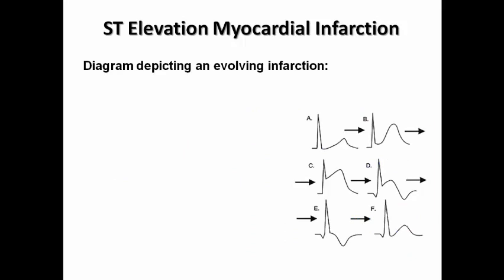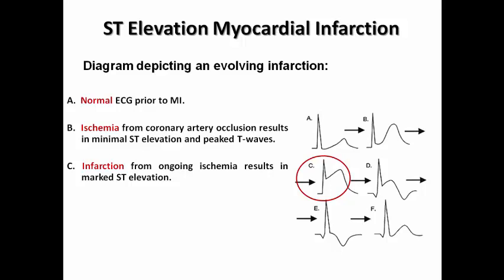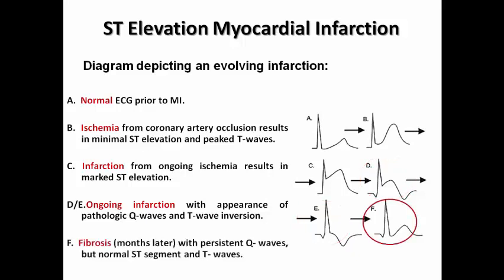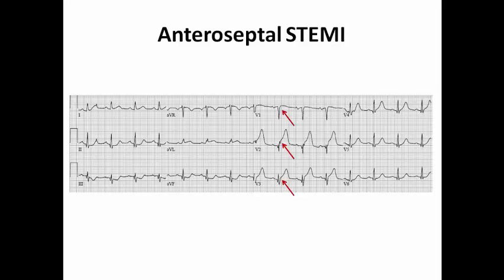There are evolving ECG changes in STEMI. Initially the ECG is normal, then the patient develops ischemia due to coronary artery occlusion, with minimal ST elevation and hyperacute T waves — the hyperacute T wave may even precede the ST elevation. Then frank significant ST elevation develops. If not reperfused in time, pathological Q waves and T wave inversion develop. If reperfusion is missed entirely, persistent Q waves remain while the ST segment and T wave return toward normal. For example, this ECG shows ST elevation from V1 to V3 — anteroseptal STEMI.